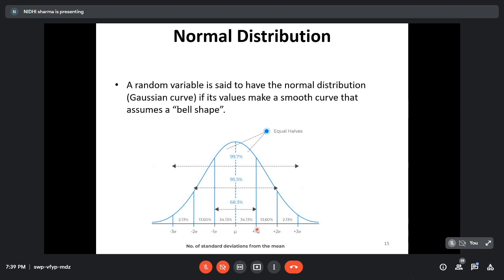we have to see that the population, the number of cells within one standard deviation is 68.3% of your entire population, if your graph has come to the shape of a typical Gaussian curve, which mostly happens in case of RBCs. 95.5% of your entire population should be within two standard deviation, and 99.7% of it comes in three standard deviation. So a bell-shaped graph or a Gaussian graph is what we get if we have a normal RBC distribution.